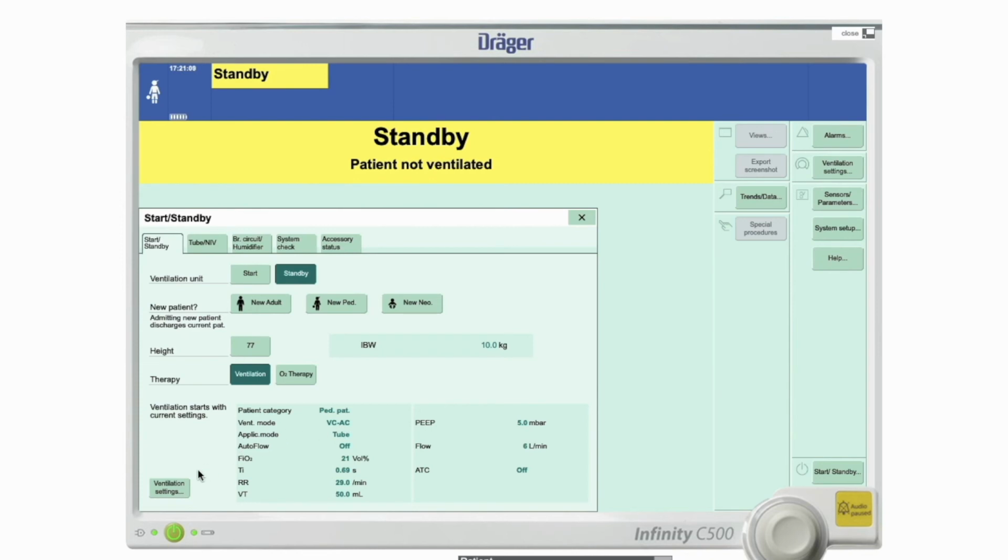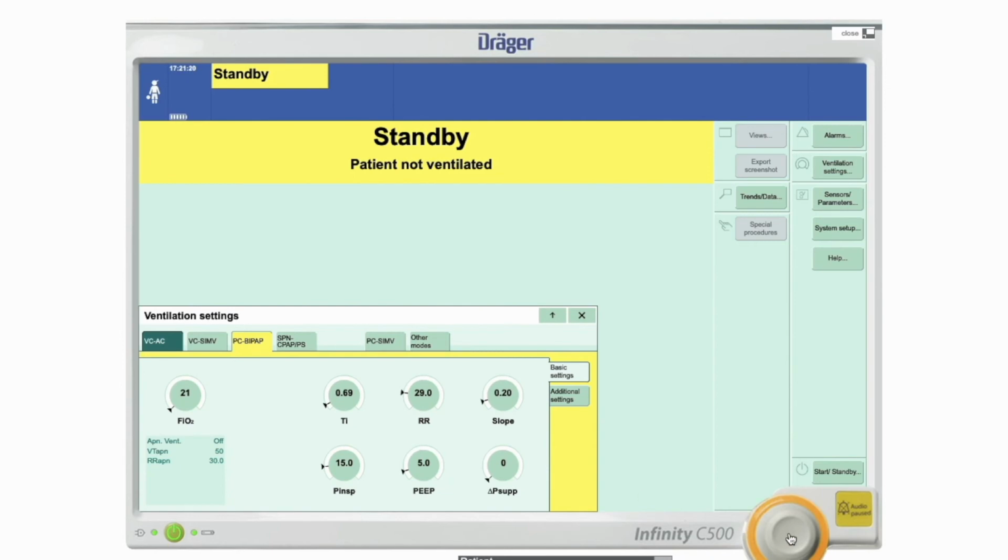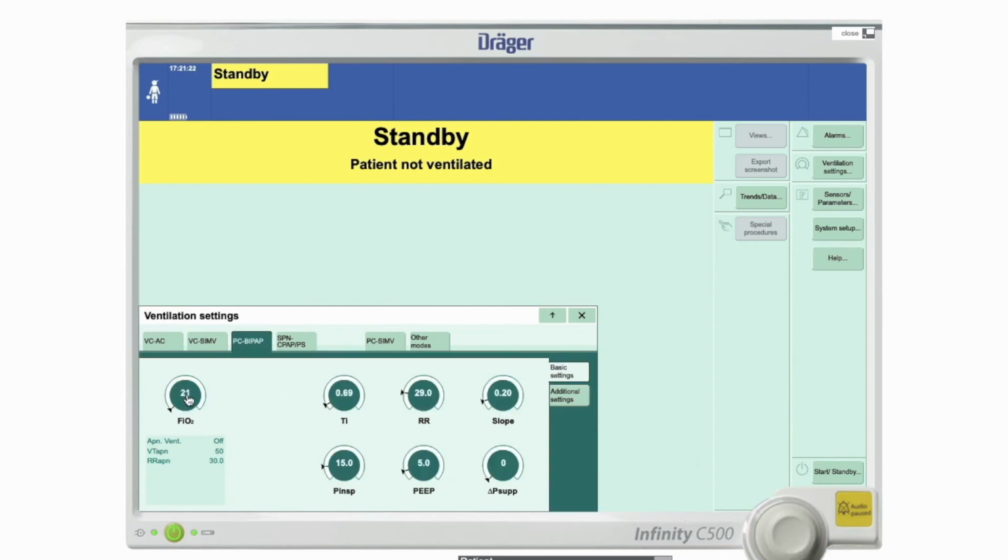It's ventilate, it's volume control, assist control. I don't want that, so I am going to change it. So you could go to BiPAP, which is absolutely fine. And then I would check the settings. I would ask the anaesthetist what they were ventilating at. They said they were ventilating at 20/5, and with that the patient had excellent gas exchange.